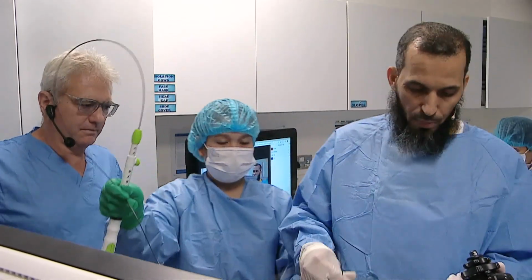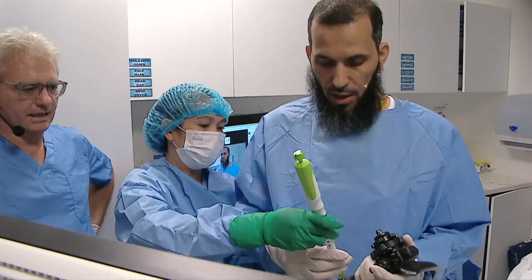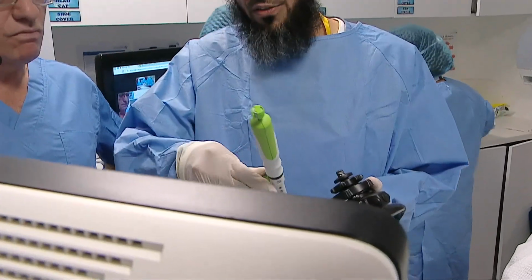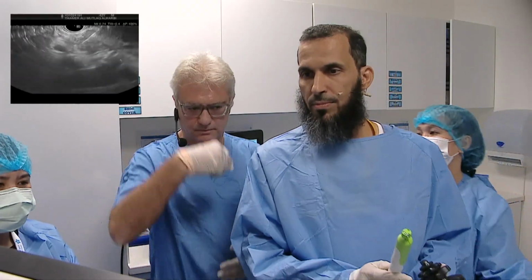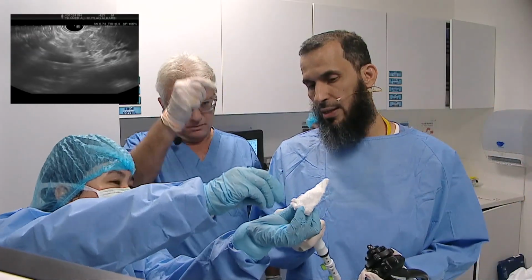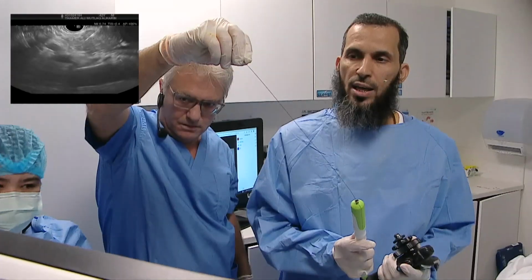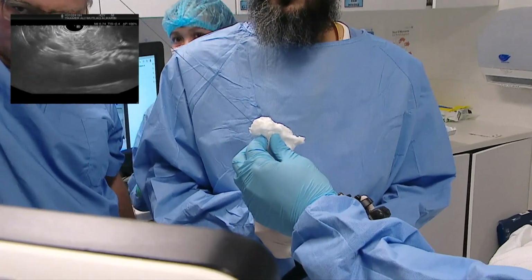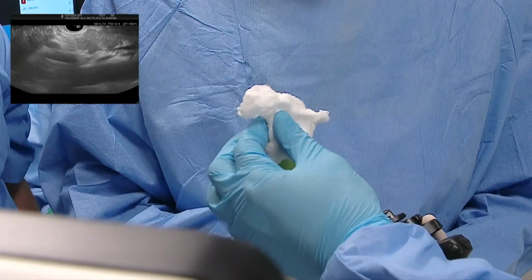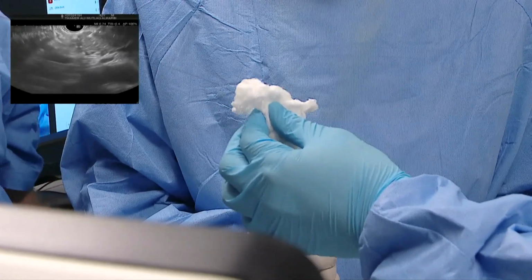So there are a lot of techniques for performing the FNB. The most proven technique is the slow pull technique, and then the wet technique. Now we have the needle. Okay. The needle is inside already. So maybe Bart can help me. Abu Ahmed, you are doing the slow pull technique? Yeah. So you have to go and then pull. Right. Then you told me to go slow. We can see here the pull is gradual. So this is the slow pull technique, which has shown results as good as wet suction in biopsy.